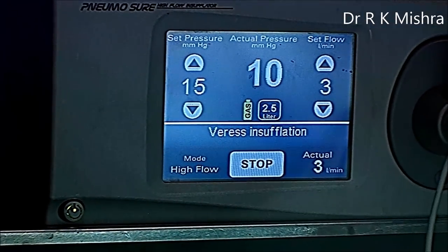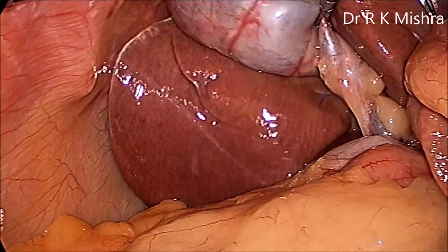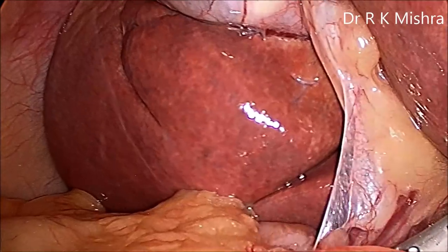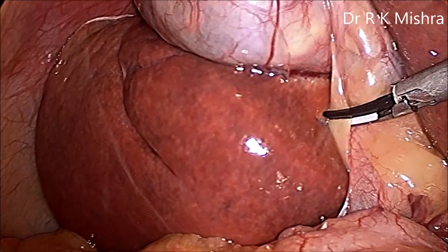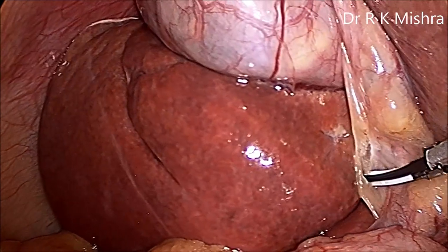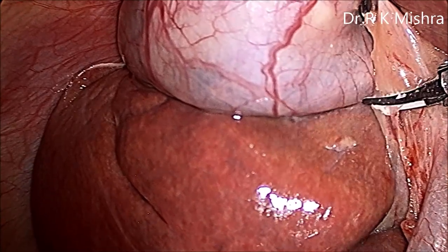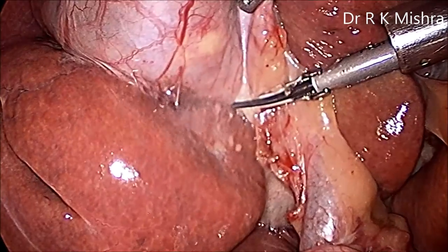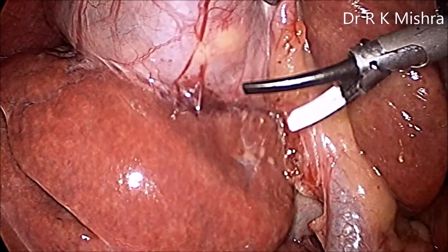Here we are using the port with 15 mmHg preset pressure. The gallbladder fundus has been pushed towards the diaphragm and after that we will start the dissection. Here is the Rouviere's sulcus, and just above it we have started dissecting the posterior peritoneum. The left hand should give anteromedial traction, and then you can dissect the peritoneum posteriorly up to one third of the body of the gallbladder, which has to be separated.